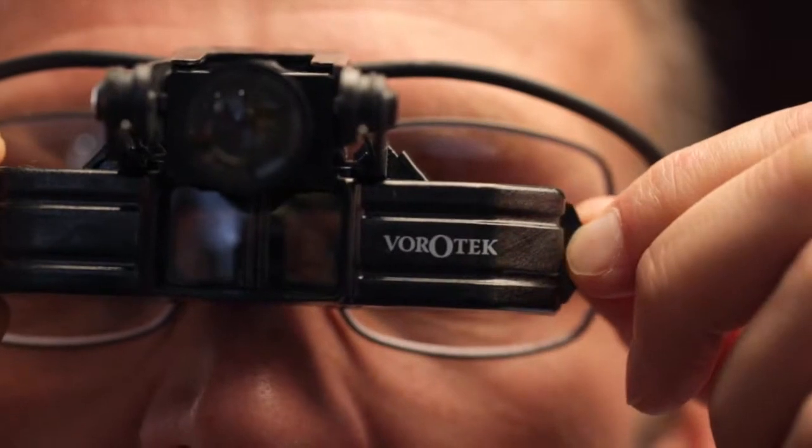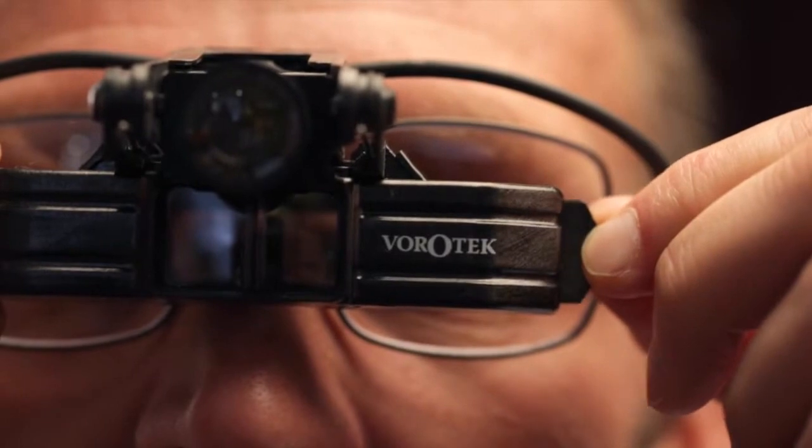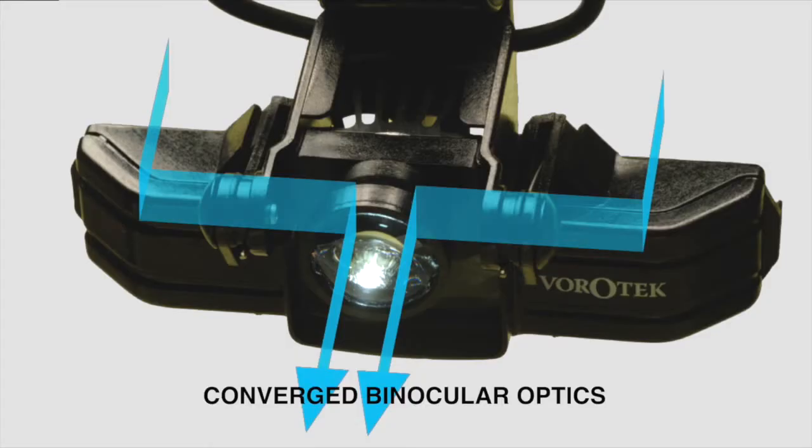To adjust the interpupillary distance for correct alignment, simply slide the tabs located at each end of the converged binocular optics. This moves the mirrors to match your eye width. The correct alignment will occur when your pupils are in the centre of the viewing screen.